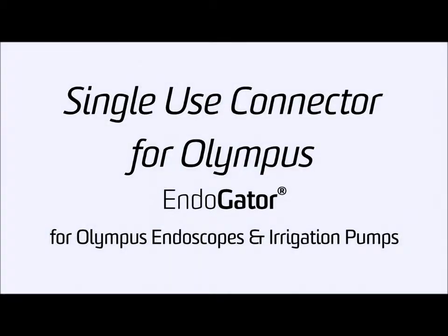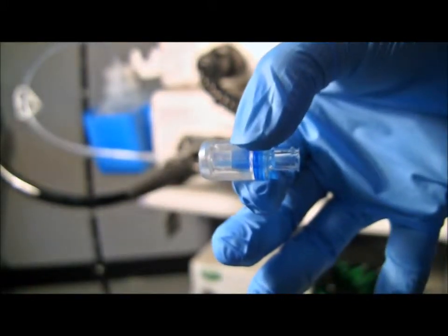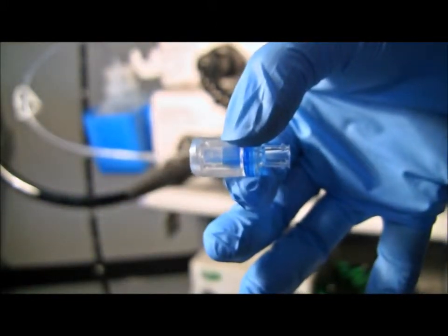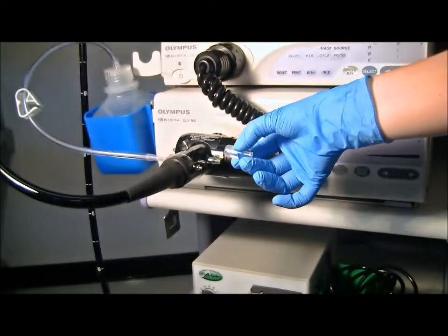Seen here, Burn Medical also offers one of its universal connectors, a single-use auxiliary water port connector for Olympus scopes. Unlike the multi-use version, the single-use connector is made of various plastics and contains its own anti-reflux valve.